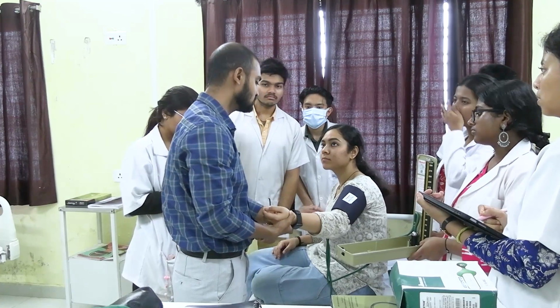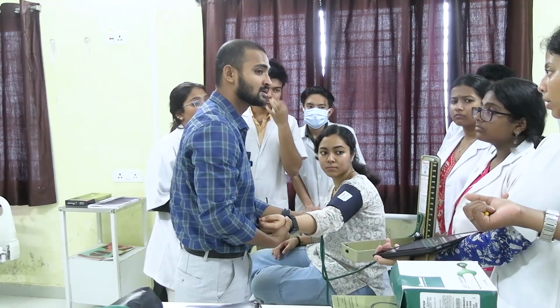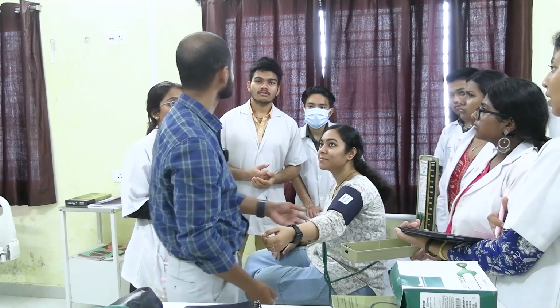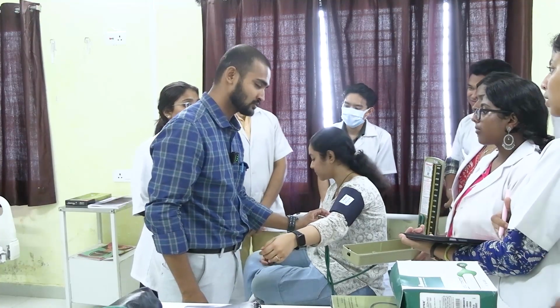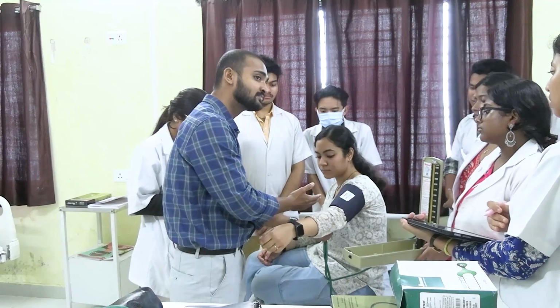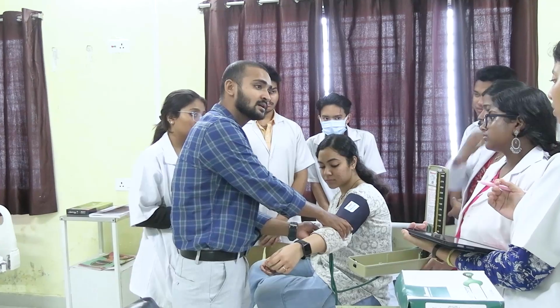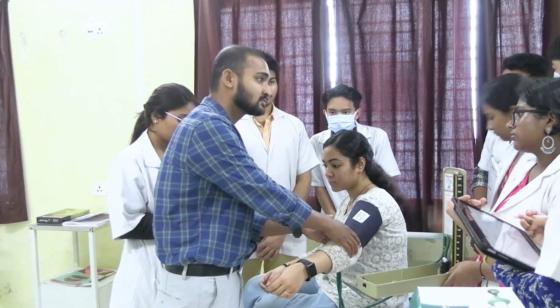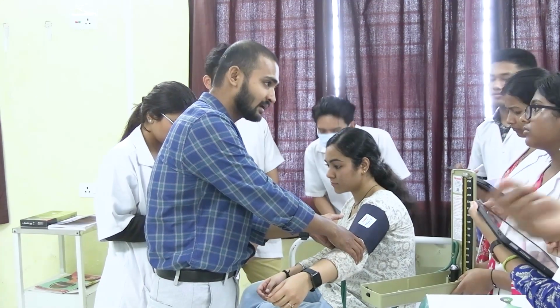Okay. So where should we palpate? Medially, between the biceps and triceps. This is the cubital fossa, above the cubital fossa, na, the antecubital fossa. And it should be medial to the tendon of the biceps. In that position we have to palpate the brachial artery, right?